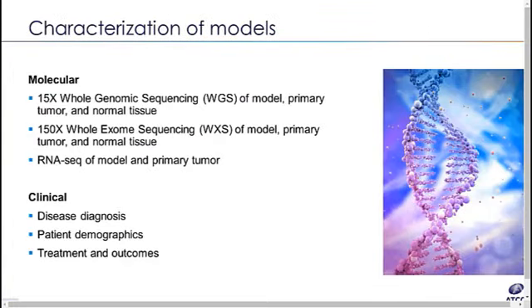One important aspect of the uniqueness of these models is the level of characterization that they undergo. This includes molecular and clinical data. The desire is to make available whole genome sequencing and whole exome sequencing. As previously stated, this sequencing is done on the original biopsies. A significant amount of patient data is also collected, which includes the diagnosis, patient background demographics, and the treatment that patients received, as well as the resultant outcome. A little later on in the presentation, I will show you where this data can be accessed.